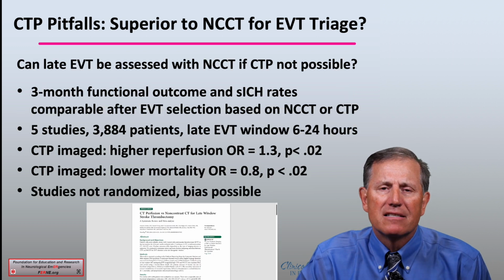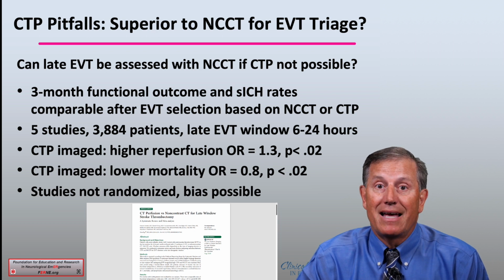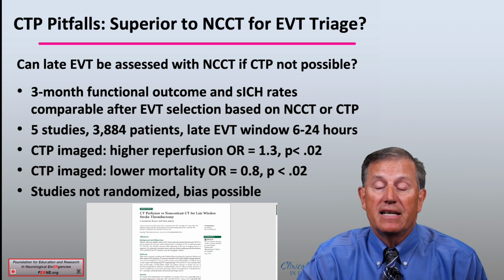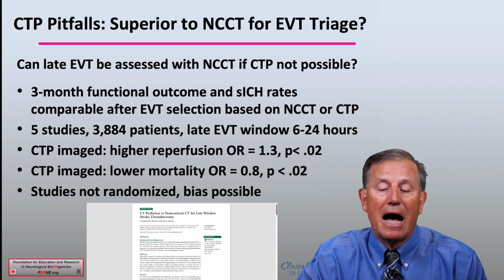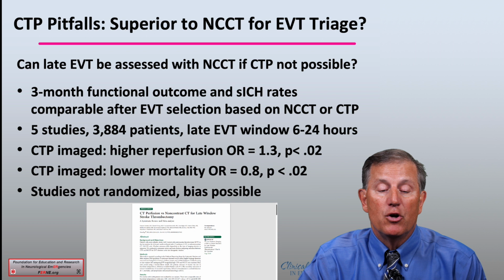So is it possible that the use of late EVT can be successfully determined with a non-contrast CT for those of you who work in centers where CT perfusion is not possible? So again, from a study listed here, the 3-month functional outcome and symptomatic intracerebral hemorrhage rates were comparable after EV selection based on either the non-contrast CT or CT perfusion.